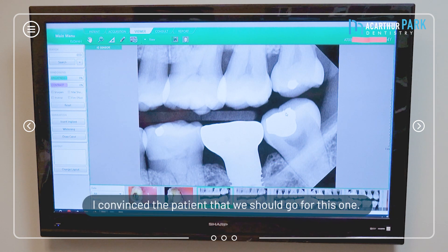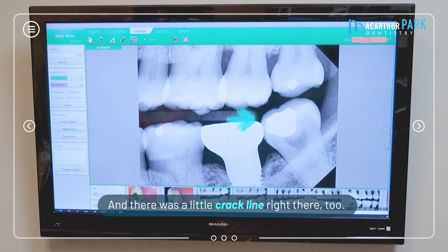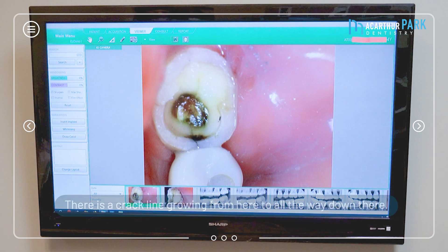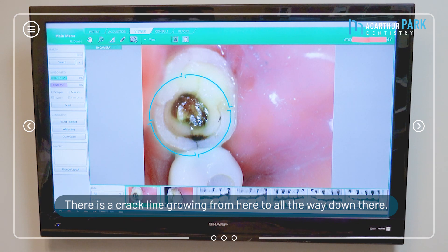So I convinced the patient that we should go for this one — there was a little crack line right there too. What we did was remove all the filling, and this is what it looks like: there is a crack line growing from here all the way down here.